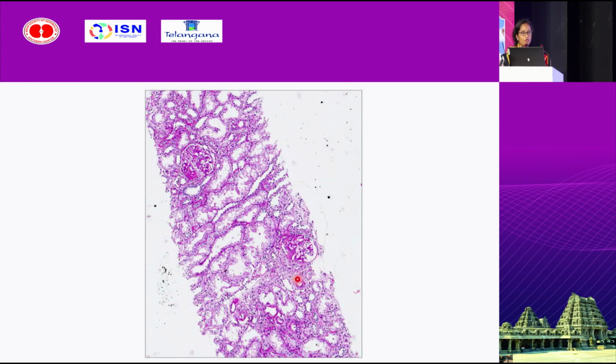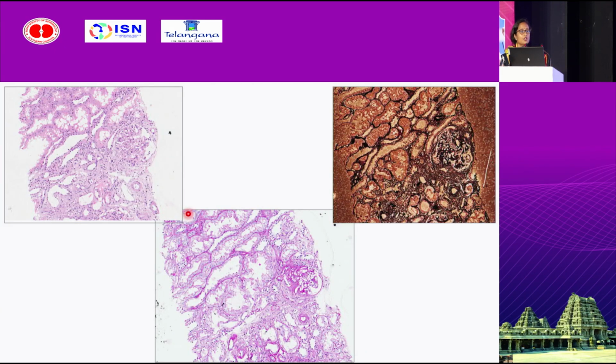This is another glomerulus which shows a segmental fibrocellular crescent, and the underlying tuft shows sclerosis. The proximal convoluted tubules here appear unremarkable, a bit of atrophic tubules in this area. By and large, the tubulointerstitium doesn't show many changes here. So here, all the 3 sections show the same glomerulus which showed the crescent. This is a silver stain showing the same.